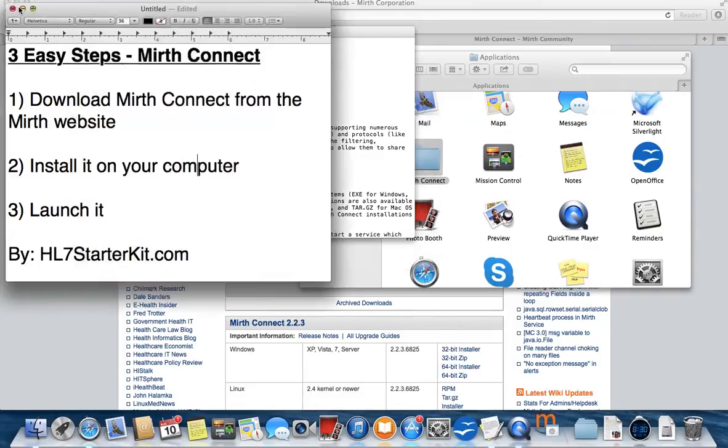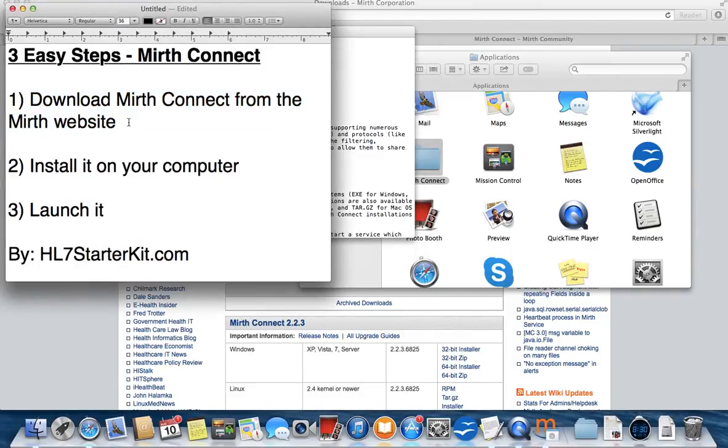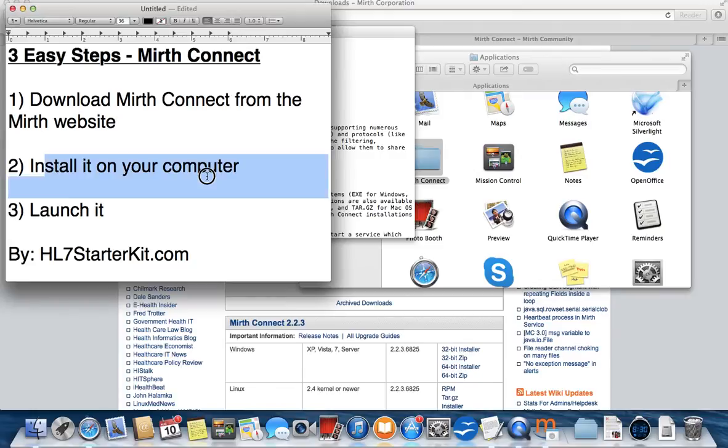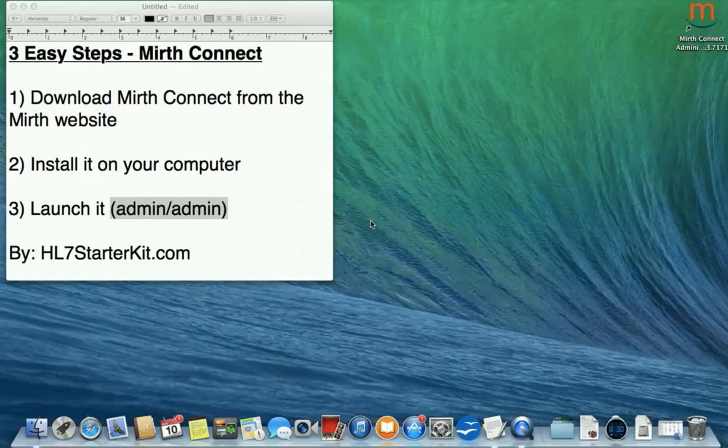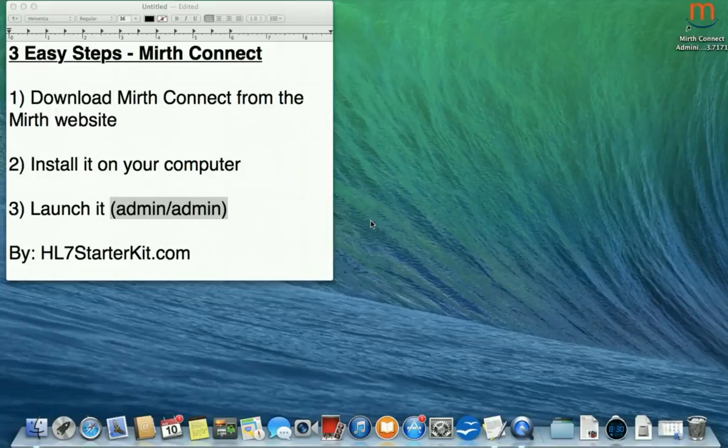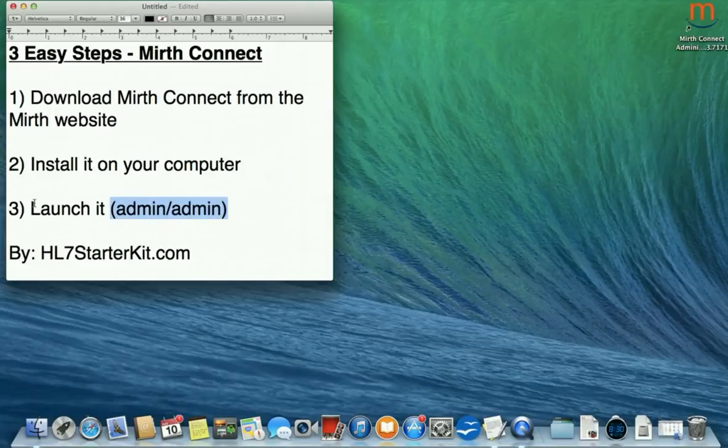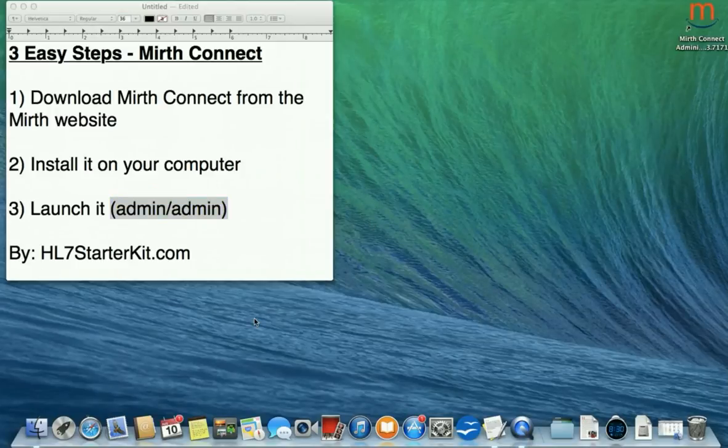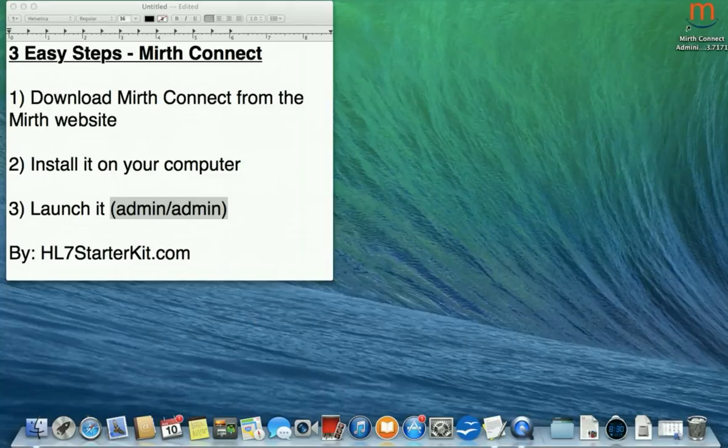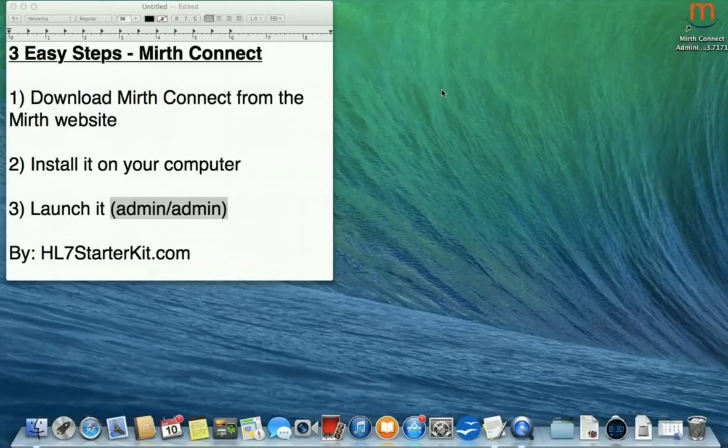Cool. So step one: download Mirth Connect from the website. Perfect. Step two: install it on the computer. We did that. Lastly, let's launch it. Okay, now it's time to launch Mirth Connect. Usually after the first time you launch it, you get a little icon here. You can launch it that way, I believe. But I like to go straight to the web browser. So let's do that. Also, keep in mind that the default username and password is admin admin.